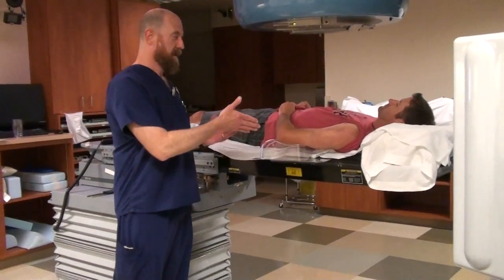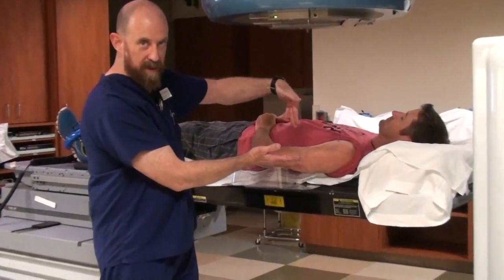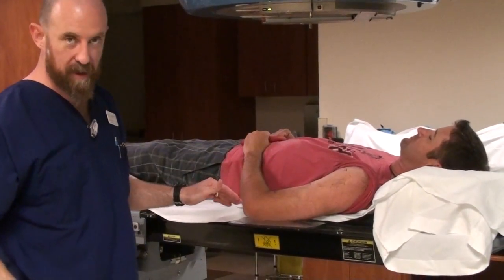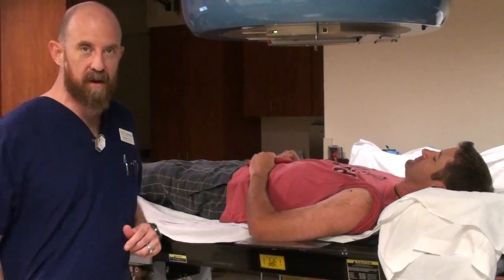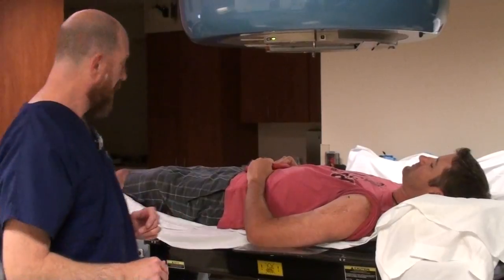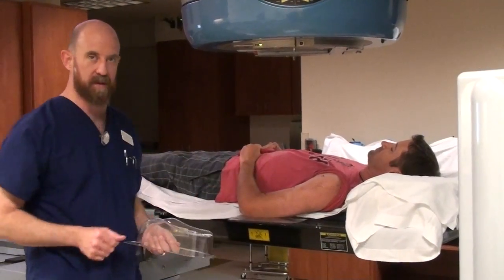For extremity treatment, if you're going to treat a humerus, the first thing you want is the limb itself perpendicular to the radiation beam. Without a headrest, you've got a lot of slope between the shoulder and the elbow. That causes the radiation to have significantly different SSDs all the way up and down the treatment field, giving you an uneven treatment throughout what is supposed to be a mid-plane treatment. So you need to build the elbow up so that the humerus is perpendicular to the radiation beam.